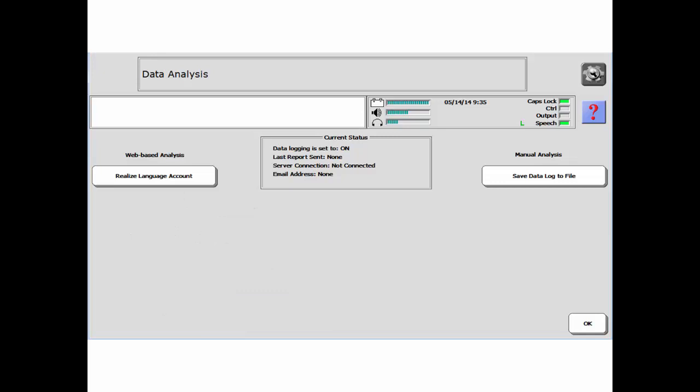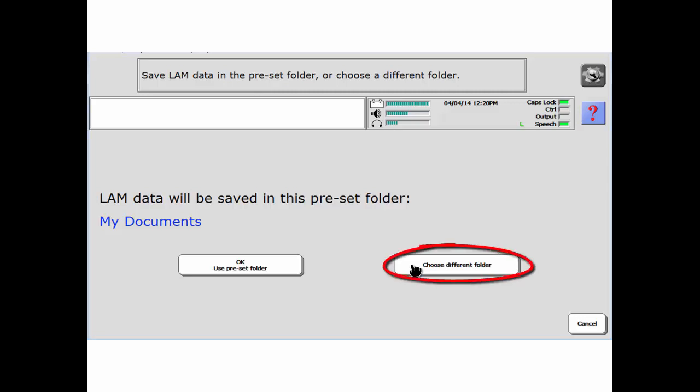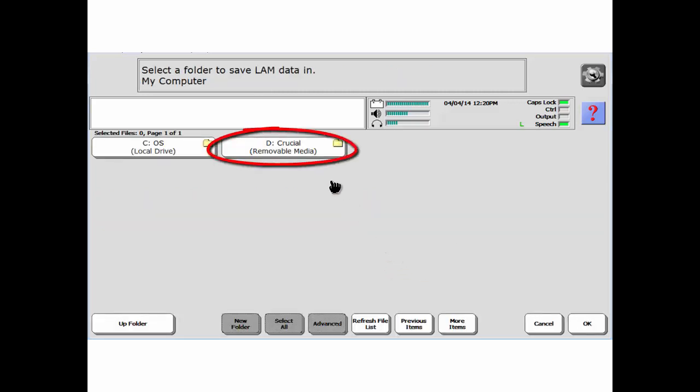To manually save your data file, plug a USB flash drive into a USB port on either the side or the back of the device. Then select Save Data Log to File. Make sure the destination is set to the flash drive. If not, select Choose Different Folder and navigate to that drive. My device is set to My Documents, so I need to choose a different folder and then my D drive or flash drive.